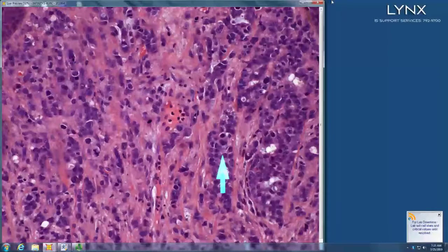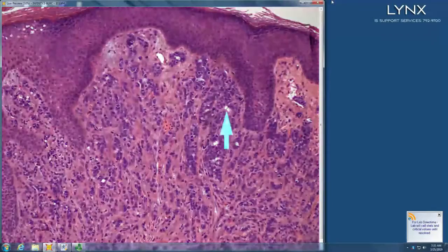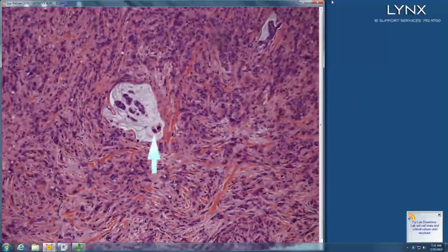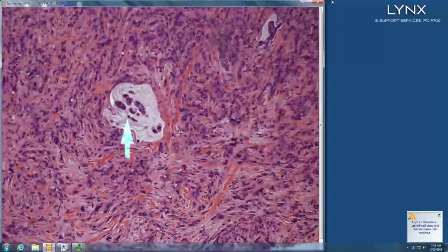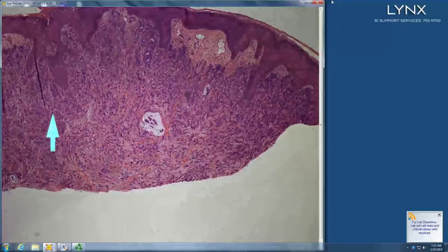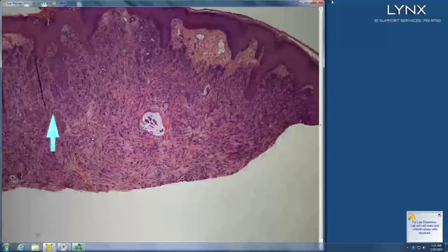Tell me about nuclear cytoplasmic ratio. Looks high. So high nuclear cytoplasmic ratio, atypical mitoses, rows of cells, some little white circles within the islands, and in some areas cells with a lot of big blue nuclei floating in a sea of mucin. So that makes me think of mucinous carcinoma. Yeah, so the whole thing is a metastatic adenocarcinoma, portions of it almost in a carcinoma en cuirasse type pattern and parts of it in a mucinous carcinoma pattern.